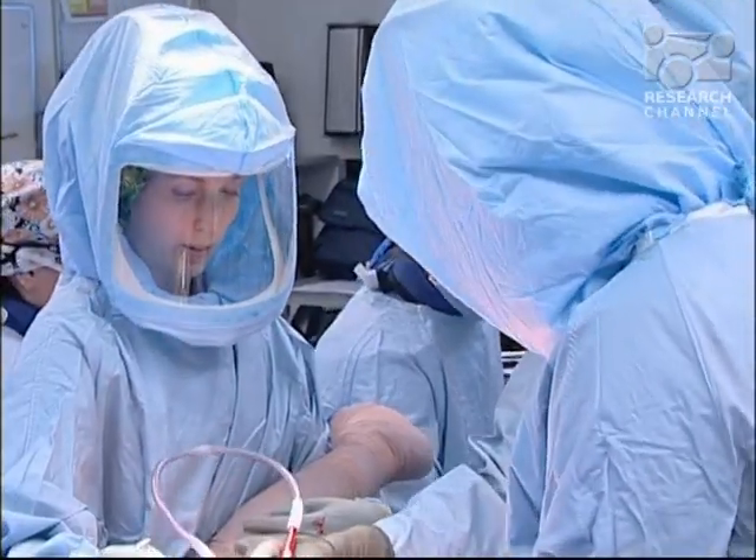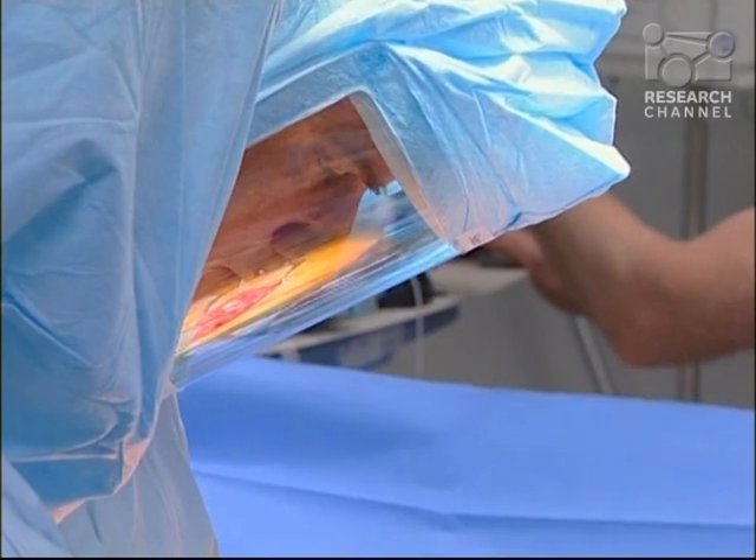John was referred to Dr. Jason Weistein, a member of the UW Medicine Orthopedics and Sports Medicine joint replacement team. Dr. Weistein will perform a procedure called bone-sparing total hip resurfacing arthroplasty.